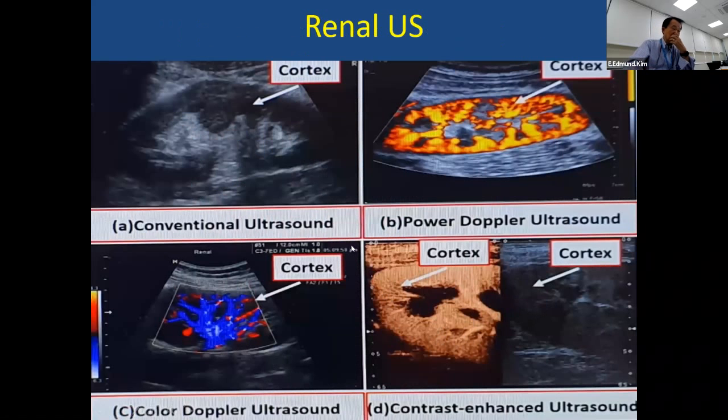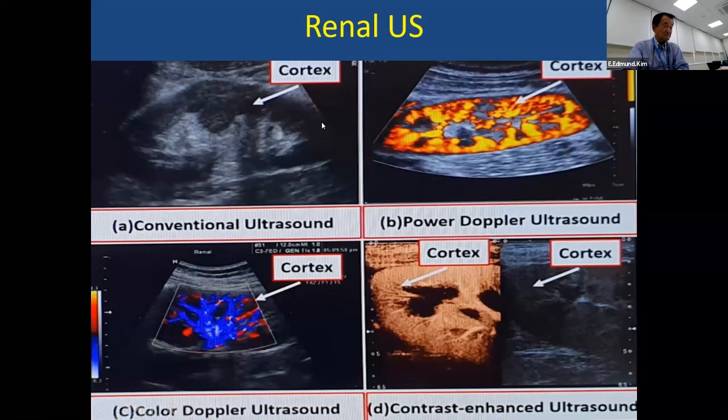And obviously ultrasound shows anatomical abnormality very easily. So if any renal disease is suspected, the clinician usually starts with the renal ultrasound. And certainly you can see cortical thickness, and using Doppler you can see flow phenomena and measure resistance from some of the vascular systems.